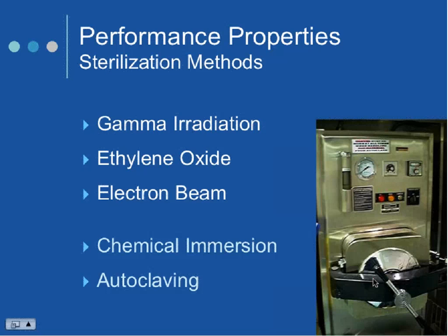An electron beam is the 3rd category. Again, that's a very expensive way of sterilizing parts, so I've only seen a couple of electron beam sterilizers from plant, but it's a far friendlier method than gamma radiation. It's a much shorter exposure. So you don't see that color shift, you don't see the embrittlement as often.